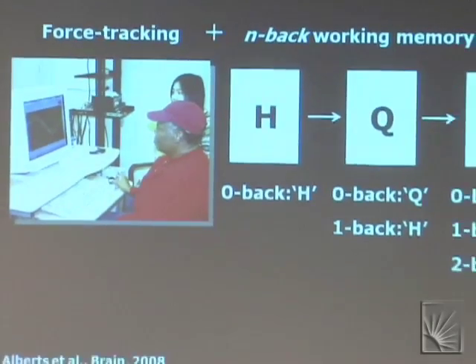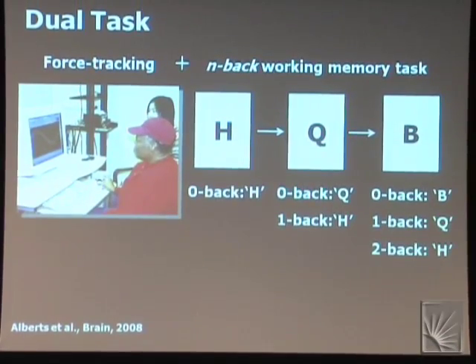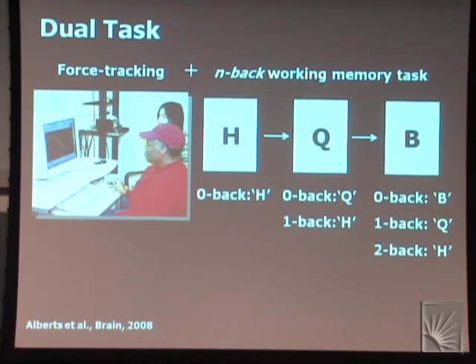as the cognitive demands become stronger and stronger, your ability to do things at the same time will be diminished. And that's true under any circumstances, but it's even more diminished during deep brain stimulation. And so the idea is to try and make things be similar to the way that they are in real life, where you're doing two things at once. You're talking and you're walking. You're doing cognitive and motor things together all the time. And so how can we sort of quantify that more real life situation?